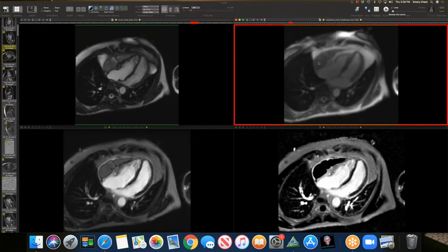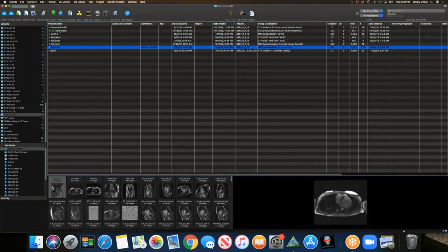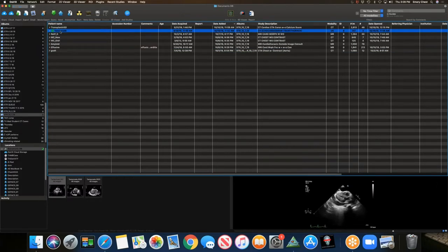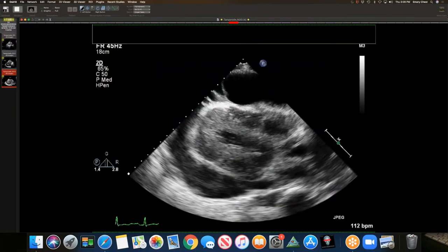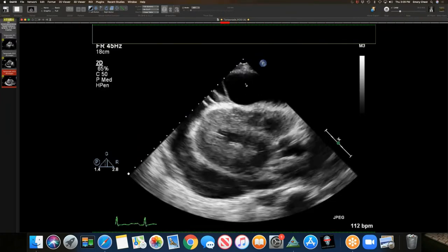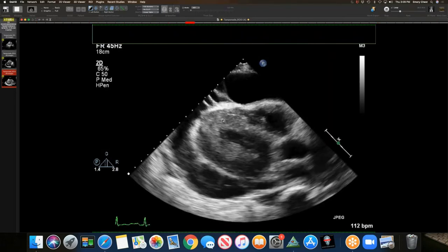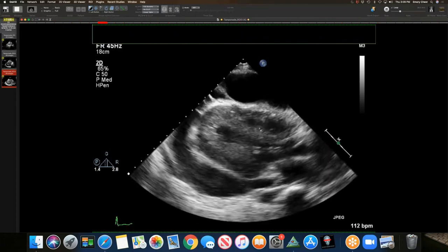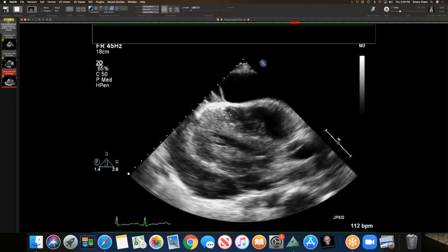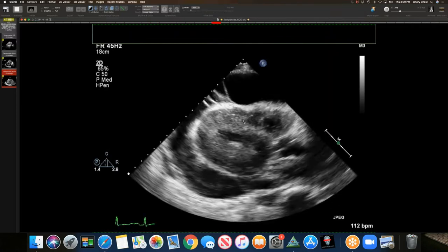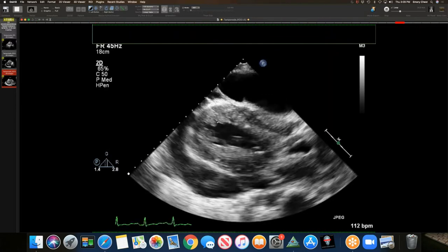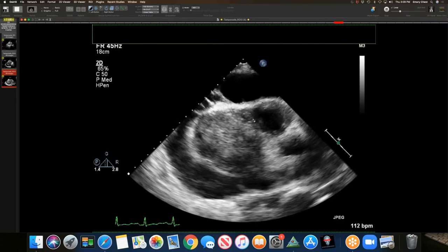Overall, the diagnosis here is effusive constrictive pericarditis, where you have two physiologic processes: pericarditis with constrictive physiology, and increased pressure within the pericardial space from the effusion — so there's likely an element of tamponade physiology. I'll show a similar case. This one I saw about a year ago, and a few days ago I ran into a similar case at our other hospital. This is a younger patient, 26-year-old with sickle cell disease who presented quite ill. You can see a large pericardial effusion, septations within the effusion, and this is pretty unequivocal tamponade with pressure on all chambers and collapse of the atria.